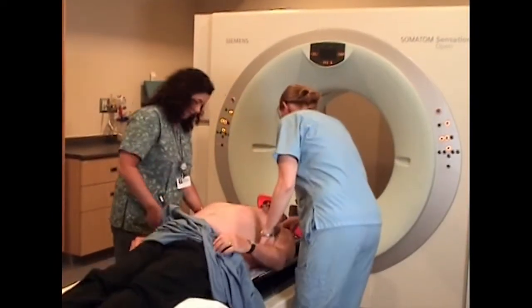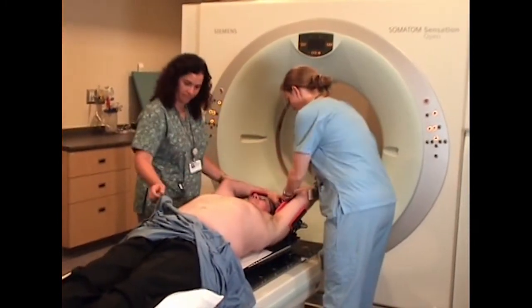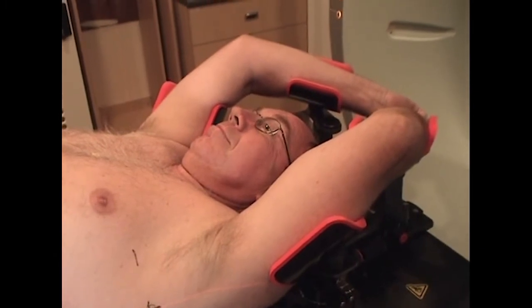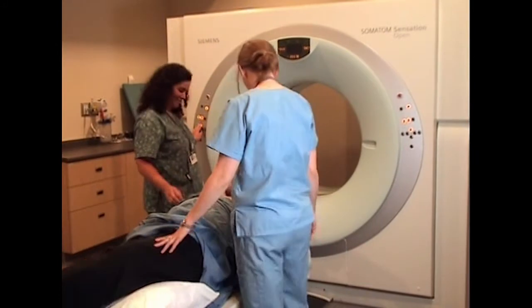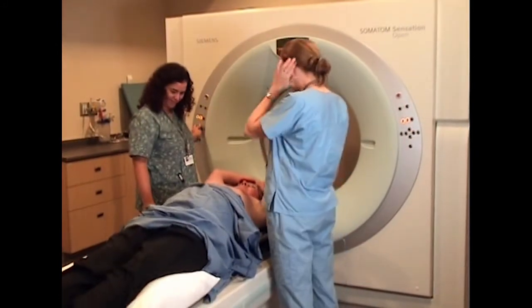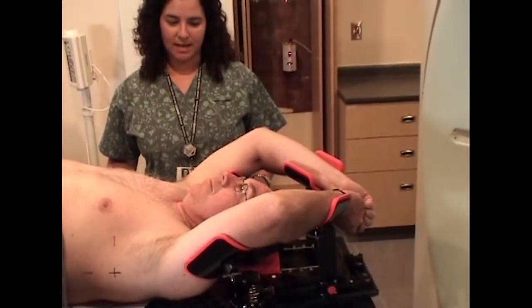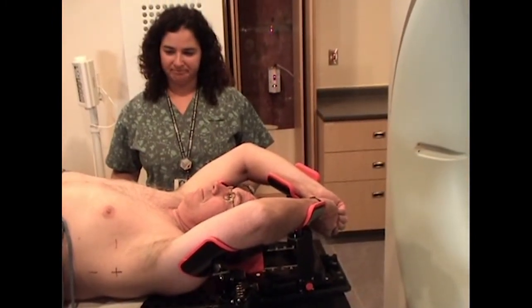In the suite, you will be asked to lie down on the couch where you will be placed in your treatment position. A positioning device may be used to help you maintain this position. The type of device used is determined by the area of your body being treated. For example, if your upper chest is to be treated, a positioning device may be used to place one or both of your arms above your head.